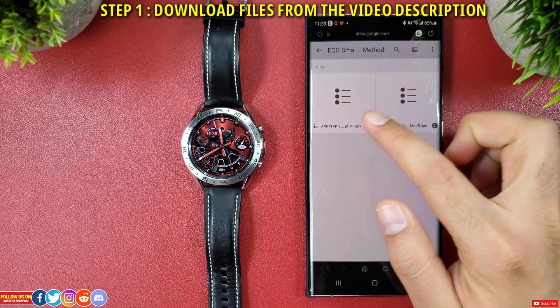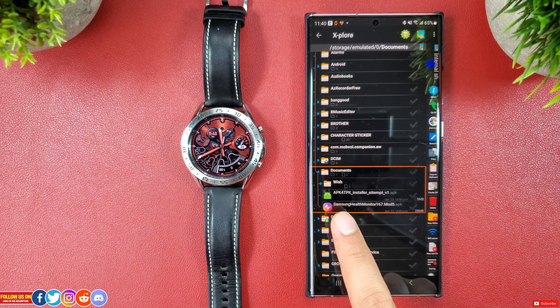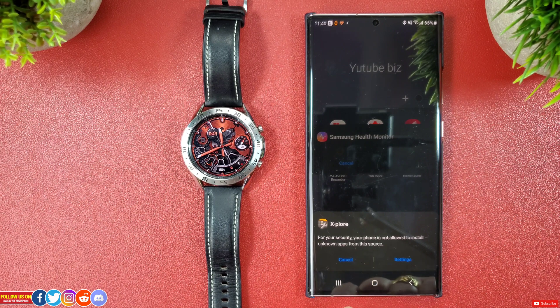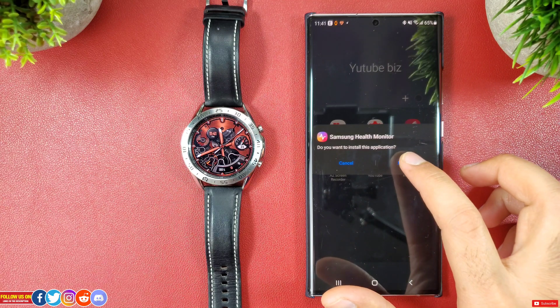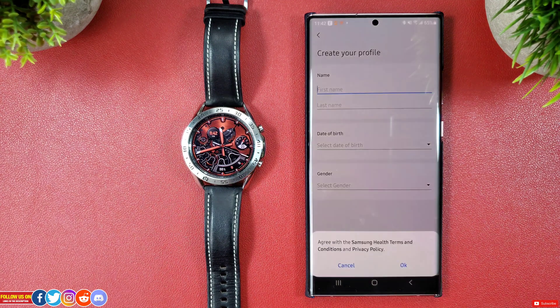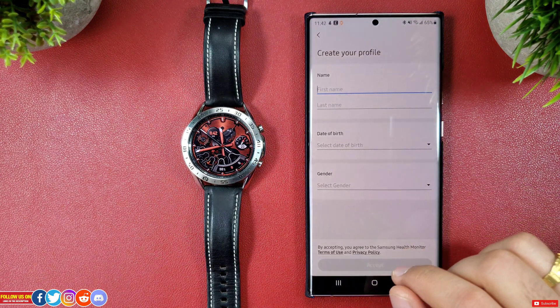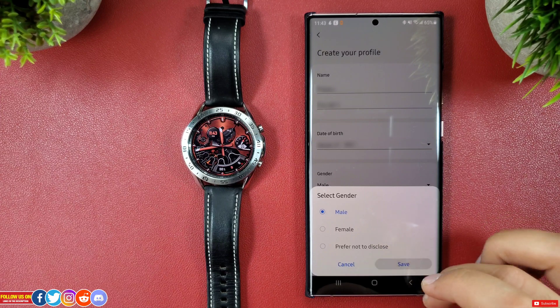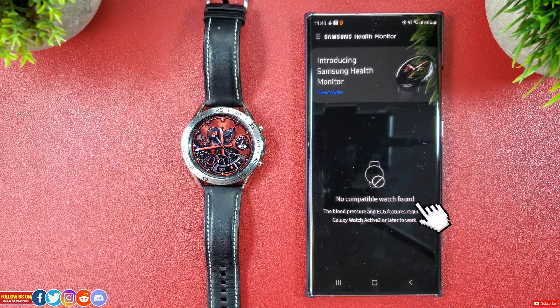To start, head down to the video description and download the two files from the first link. Once downloaded, start installing the file named Samsung Health Monitor mod5.apk. You'll get a popup that your phone is not allowed to install unknown apps, so head into settings and turn on allow installation from unknown sources, then go ahead and hit install. Once installed, open the app and click continue without a watch, agree with all the terms and conditions, allow all the needed options, and create your profile. Upon completion, the Samsung Health Monitor will start with a no compatible watch found notice.